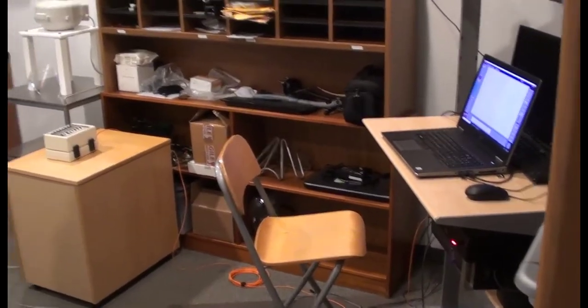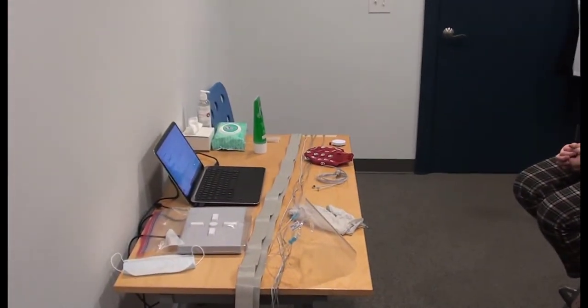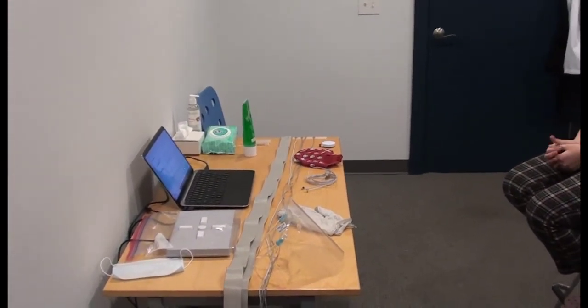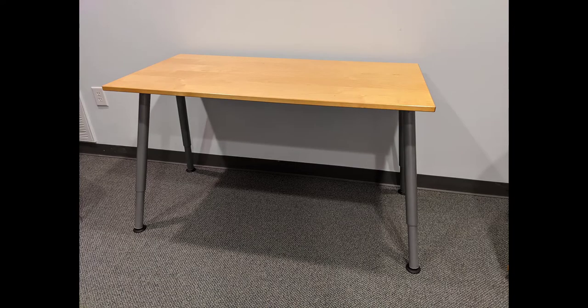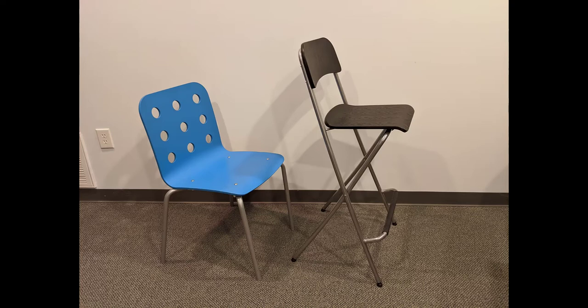When possible, choose wood or plastic furniture for your lab since any metal can exacerbate problems with induced interference from nearby powered devices. A sturdy wood table is recommended for the stimulus display and a tall stool can be helpful during cap and electrode prep. We recommend a wooden low back chair without swivel or wheels for the participant during the experiment.